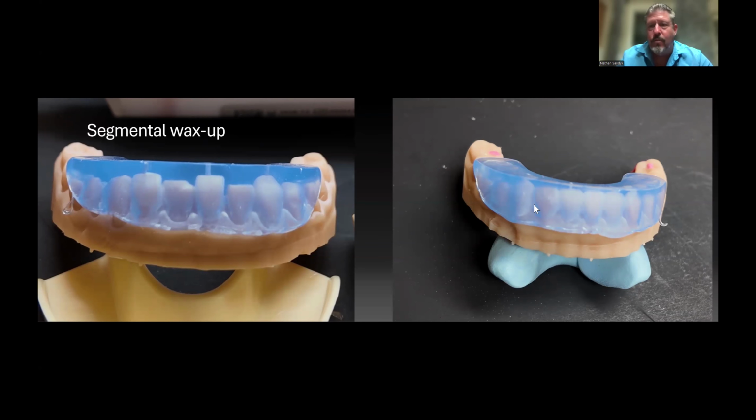Here's one where segments are waxed up. So on this side, every other tooth is waxed up. And I injection mold those first. And after I shape them, I have another stint where every tooth is waxed up, and I do the ones I didn't do the first pass through. I can do all six anterior teeth in two passes. Literally takes 20, 30 minutes.